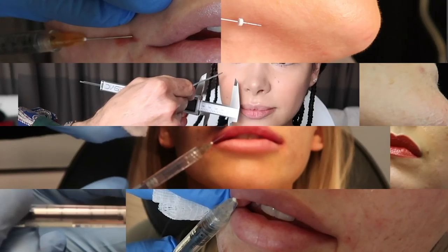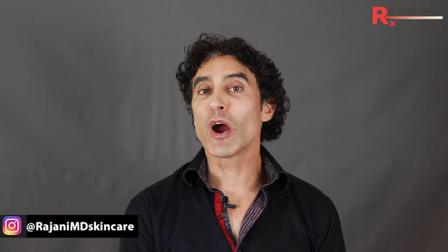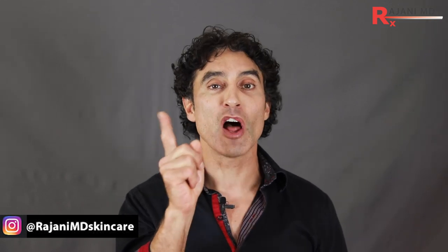Want to see a barb4 being injected into a face to lift the oral commissure — that downturned mouth that everyone's coming in for? Today we're going to inject a barb4 for the downturned mouth, one of the most common things we see from young to older. People hate that downturned mouth. We can dissolve, fill the preauricular area, fill the jawline, but for many people putting a nice lifting thread is an amazing treatment — instant results they love.